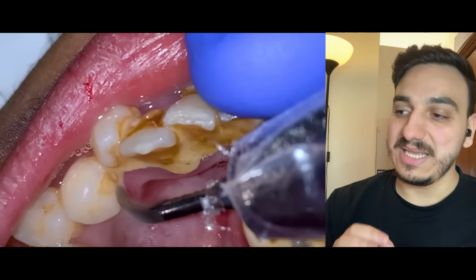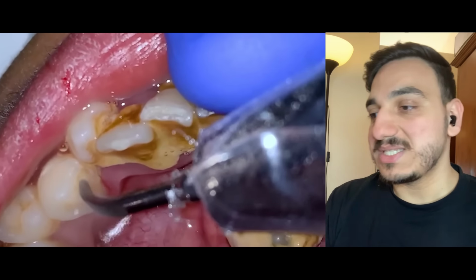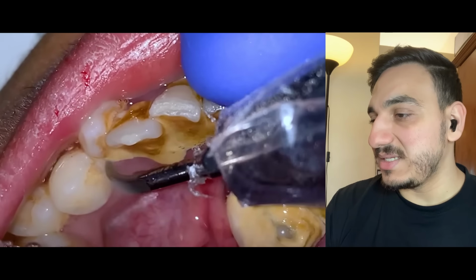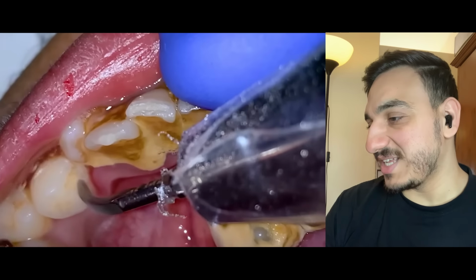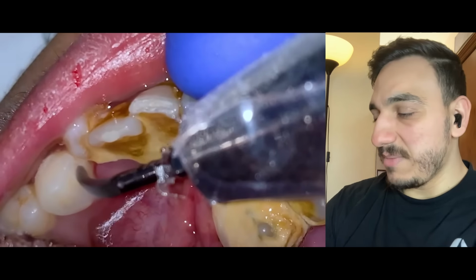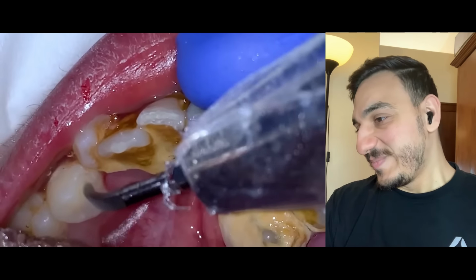It can easily go to fine places, smaller places in between the teeth in the event there's any dental tartar or dental calculus stuck in these areas. That is a huge piece of dental tartar that's accumulated. It looks like it's covering up some tooth structure. I'm talking about the things you can see. We will get to it. I told you it gets more fun as we proceed.